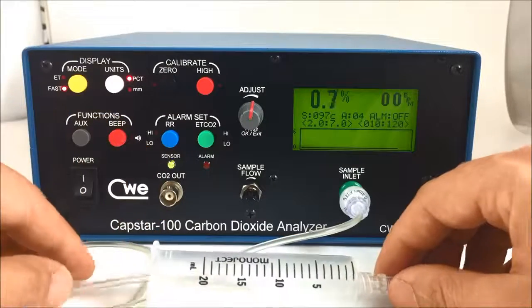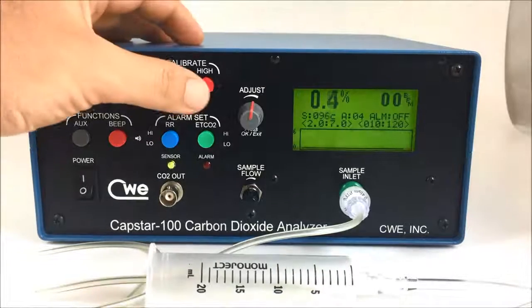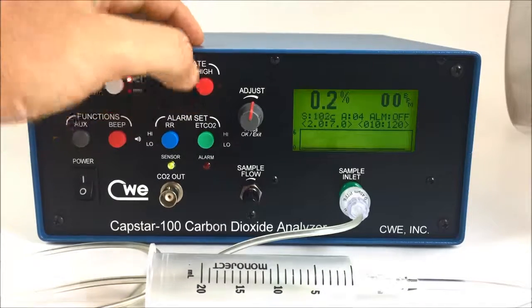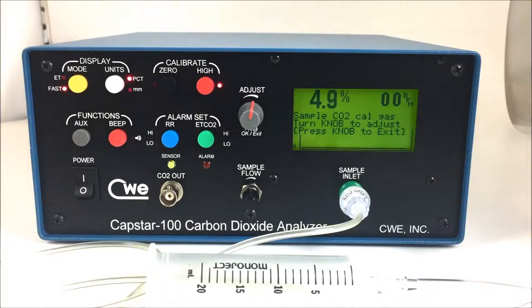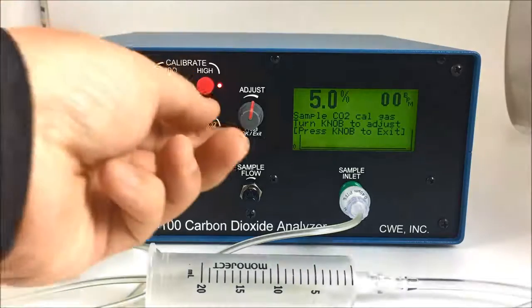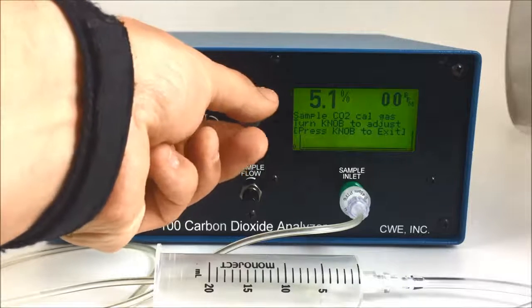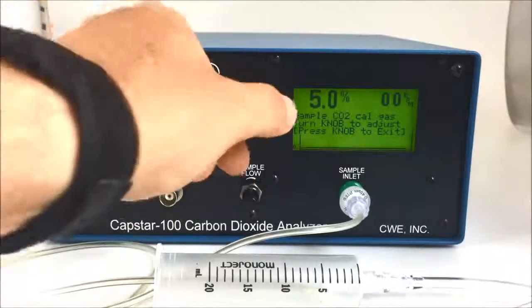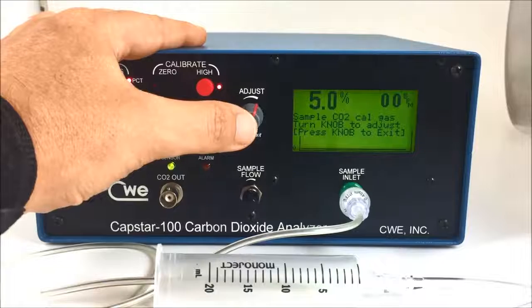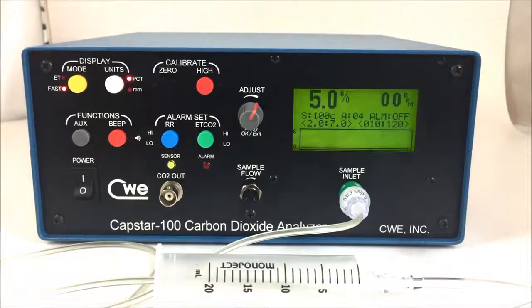I'll place the sample tubing into my syringe barrel, press the high calibration button, and turn on my cal gas. Our cal gas is 5%, and we can see that we went right to 5%. But if we were above or below that, we would simply turn the cal knob to adjust up or down. Once we've got our calibration set to the correct value for our gas, we press the adjust knob back in and turn off our calibration gas.